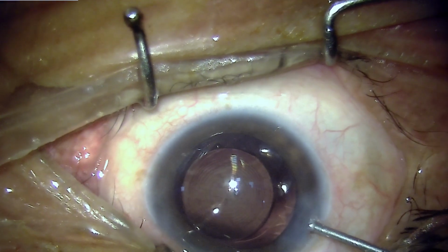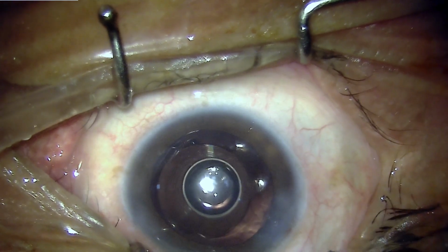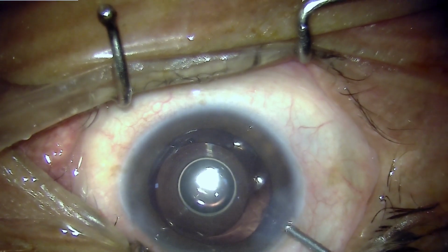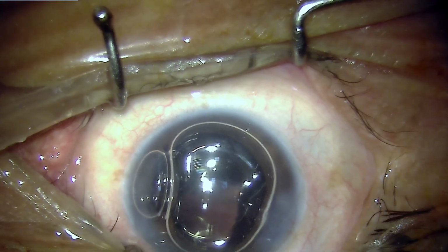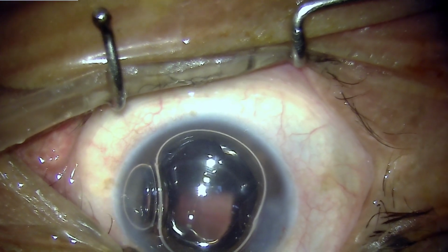So once we are sure that we have removed the vitreous from the wound, we'll place in a large air bubble, and this will help in multiple ways. It will keep the anterior chamber formed. It will also keep the IOL centered and also keep the vitreous pushed away.